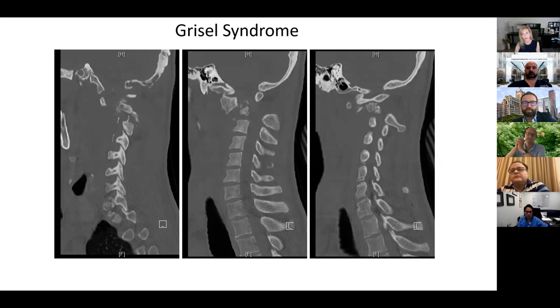And if you want to make a comment, Wendy, on what we see here. Yeah, I don't even know what to say now. Your C2 is just dissolving there too. Yes. You're not going to have any bone left there. How much time has passed? About 8-9 days since the first scan. So, IV antibiotics, but his activity was as tolerated.